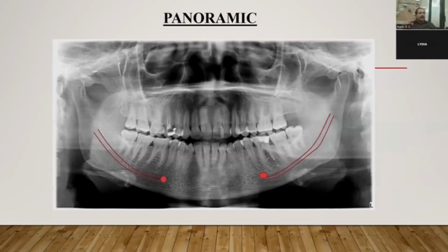So when you happen to have a case which has an intact socket, you can place an immediate implant and connect it to a root immediately next to it. Then the crowbar principle is not going to work here. So that part alone is taken care of. But in such cases, if you don't have very good interradicular bone, which is supposed to be the inter-implant tooth bone in future, then trying this will again be dangerous.